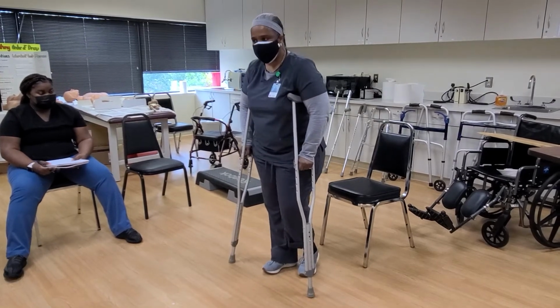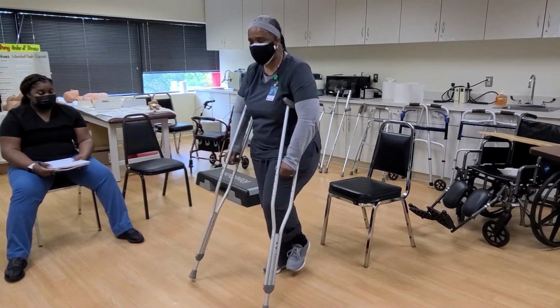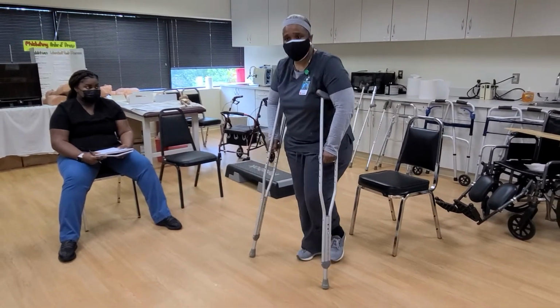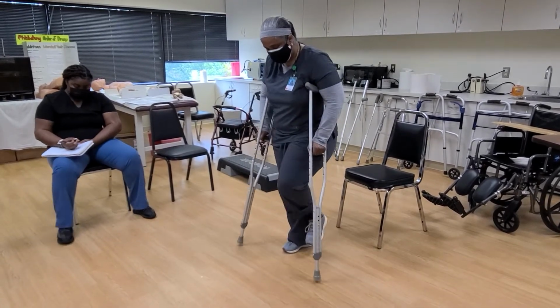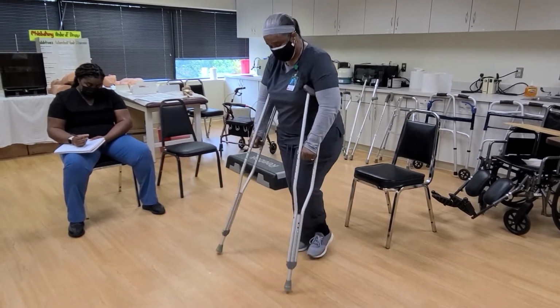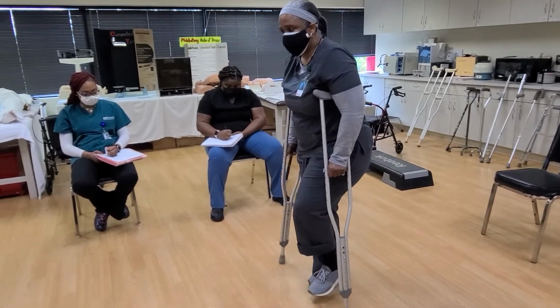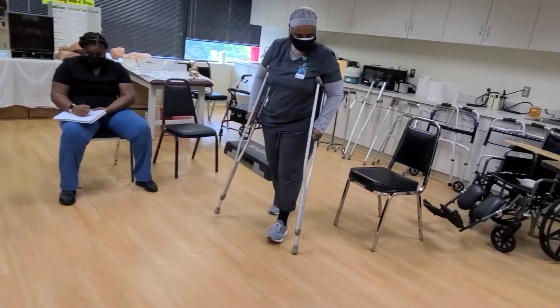Now with your crutches, the thing that you want to do, just like with the other devices, is move your crutches first, not too far out, and then your affected leg goes with it, because it's working in unison, basically taking the place of the affected leg. So you take your crutches and then swing your affected leg through, and then the not affected. Crutches, affected leg, not affected. Crutches, affected leg, not affected, okay? And that's how you're going to ambulate.